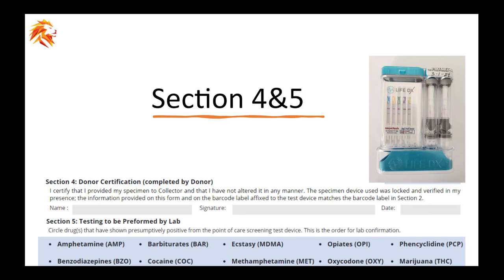Once it has been decided to send the kit to the lab for confirmation, it is very important to label the kit. Inside your kit, there is a set of 2 identical barcode stickers. Fill out the required information in ballpoint pen: the donor's name, the birthday, and the date of collection, and place the sticker over the locked swab sticks as seen here.